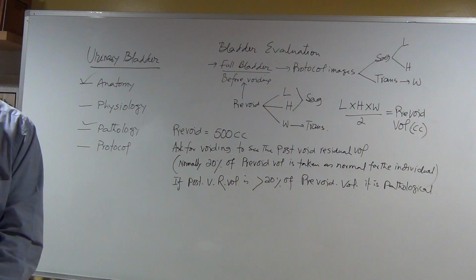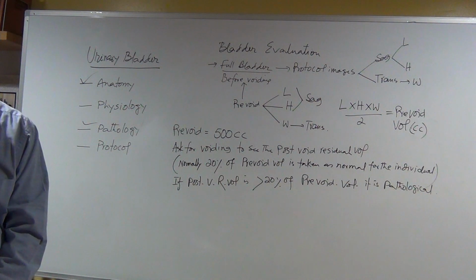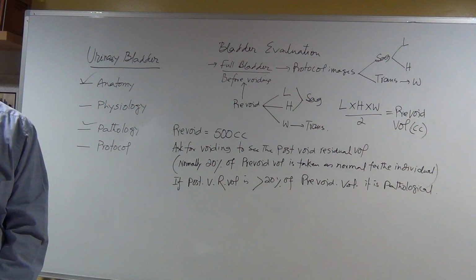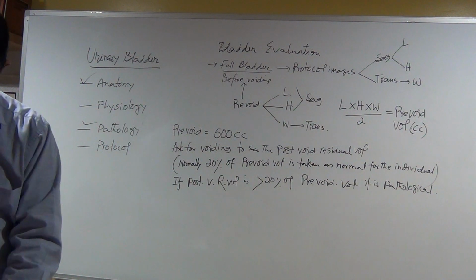It is pathological. So now I will teach you how to calculate the post-void residual volume.